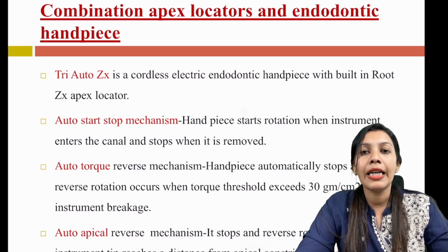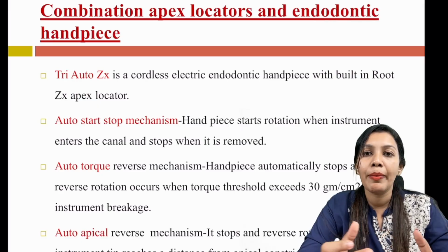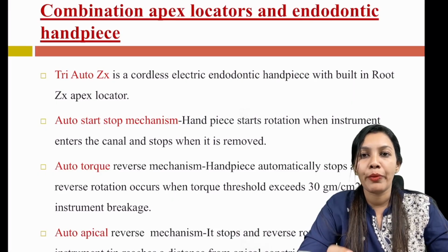And as I said earlier, radiographs are nowadays being used for apex location, like subtraction radiography, where we compare the early and last images together and subtract the unwanted image to find the working length. The most commonly used working length method is of course the apex locator, and the names of those who introduced it, Custer, Suzuki, Sunada, etc., have to be memorized.